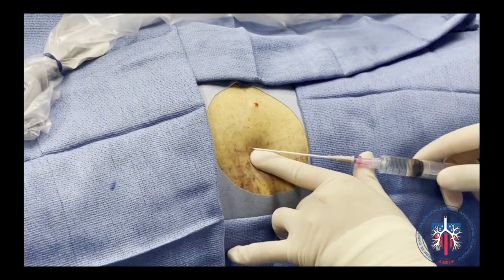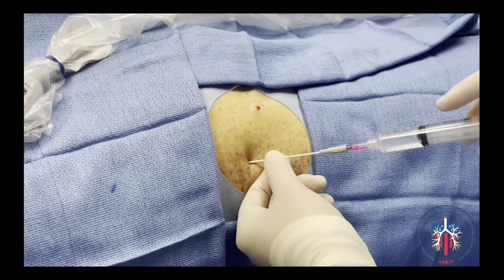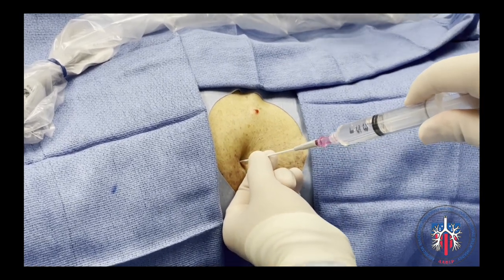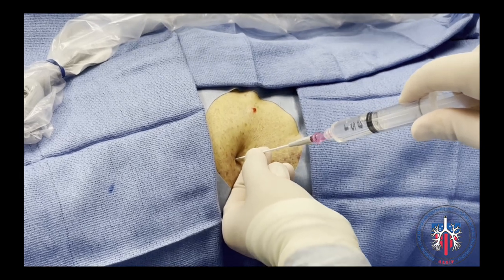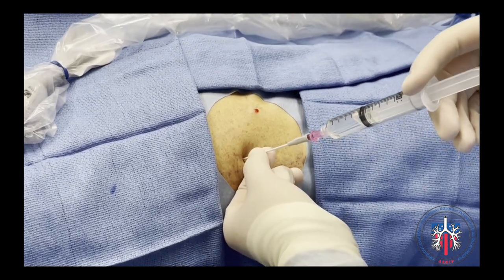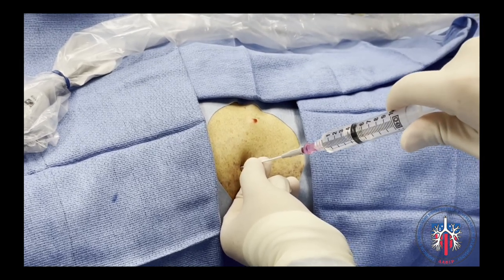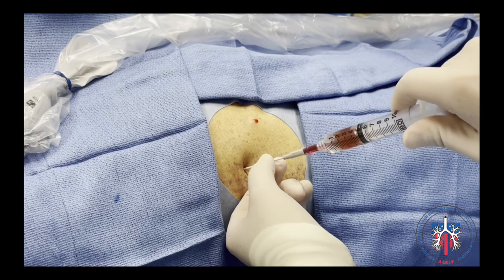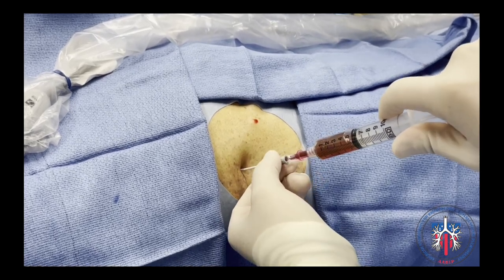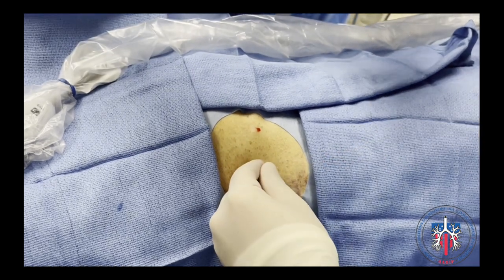Next, the finder needle, which is attached to a 10 cc syringe, is inserted via the entry site towards the pleural space. Negative pressure is applied on the syringe as the finder needle is advanced. Additional 1% lidocaine can be injected into the pleural tract for patient comfort. It is important to not change the direction of the finder needle and to remain above the rib when advancing. Once pleural fluid is withdrawn into the syringe, the catheter over the finder needle is advanced into the pleural space and the needle is then removed.